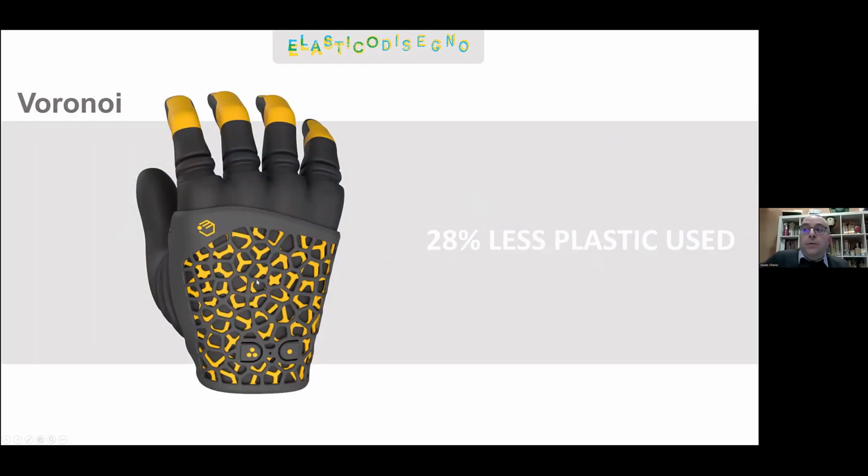All right. So we were able to generate this double Voronoi pattern, which is highlighted by the possibility of printing in color with Jet Fusion printers. In this case, we had 28% less plastic used, which is considerable. It brings a significant weight and plastic volume reduction.